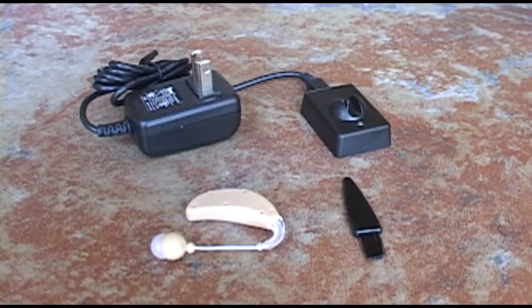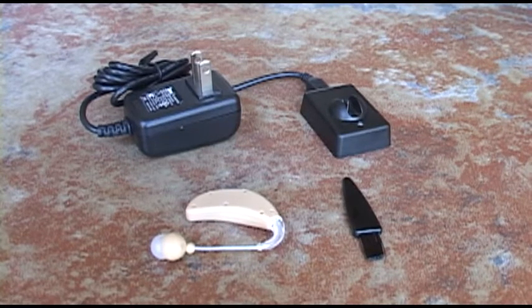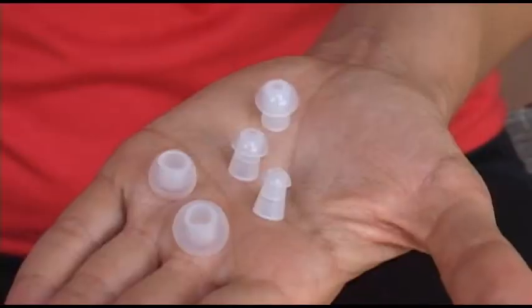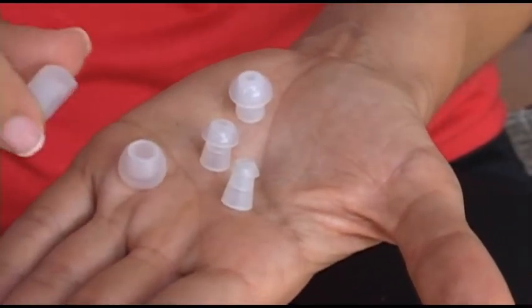The ClearHear HD is a rechargeable sound amplifier and the power adapter is included, along with a charging stand, cleaning brush, five extra earpieces, and instruction manual.